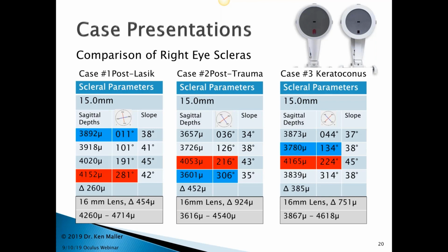I've been using Scout Topographer now for nearly 20 years. It's a tried and true workhorse for me, and I still do use it. When I purchased the Pentacam, I had the intention of retiring the Scout. I found that no, I still end up taking the corneal topography there, owing more to the database management of my wave lenses than really anything else. So I think the short answer is if you have a Pentacam, you probably can replace the corneal topographer. You certainly can get all the data that you need for corneal topography that way as well.